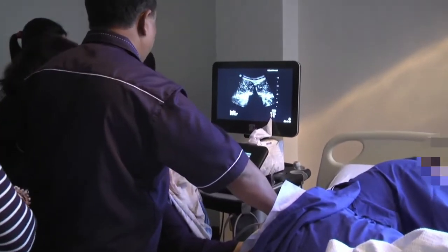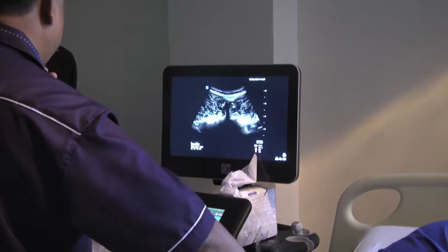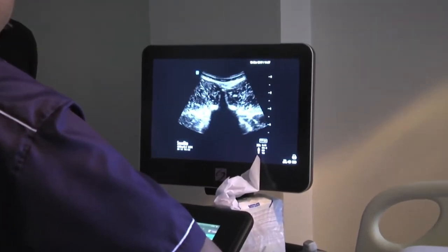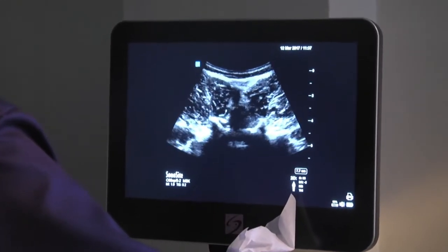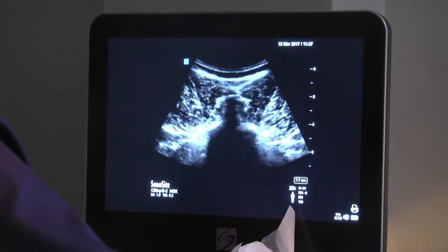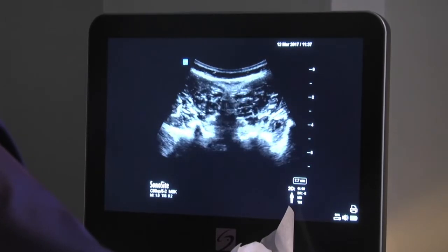So at this stage, you really don't want to know what level, whatever. I just want to see the midline, okay? And you have seen this, then you mark your transducer position and put a mark there, okay? Then you know that that's the midline. And then we just go to the interspinous space. Let's look at this one.